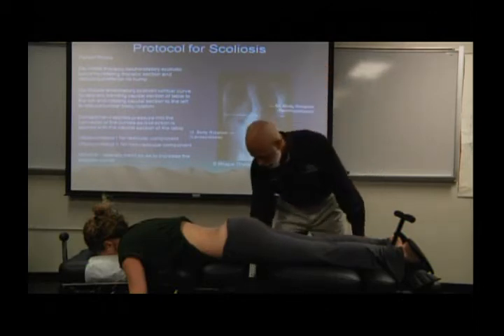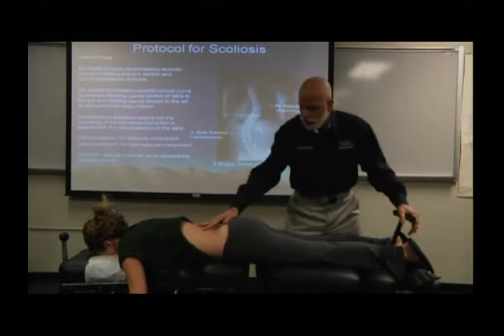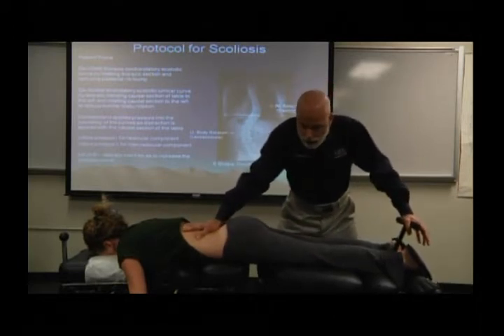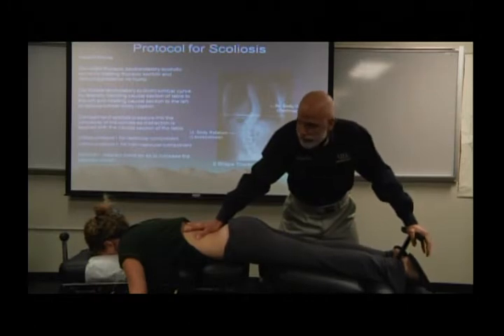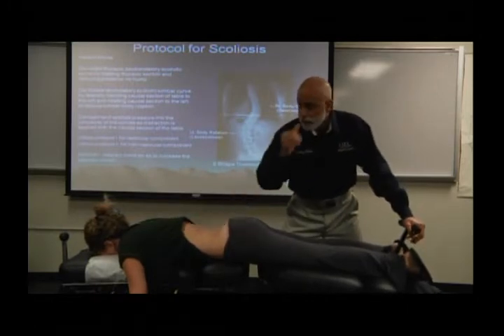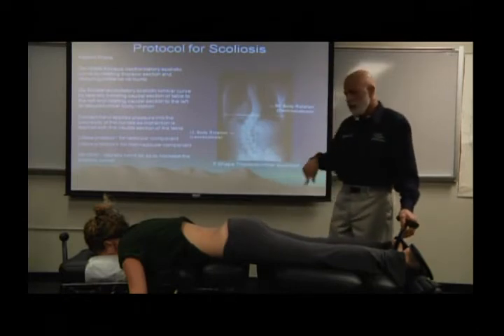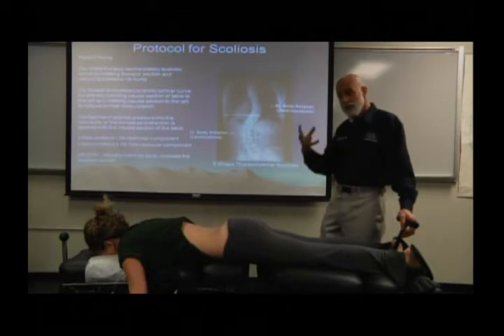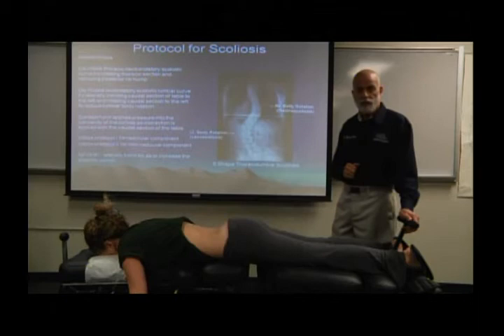We basically release the flexion lever. It's already released. Release the lateral flexion lever and get a contact on L4, and do your 10 2-second pumps in flexion. Okay, all right. Now is lateral flexion. And the problem that we run into is we really don't want to laterally flex this patient into the concavity of their curve with the potential of increasing the curvature.